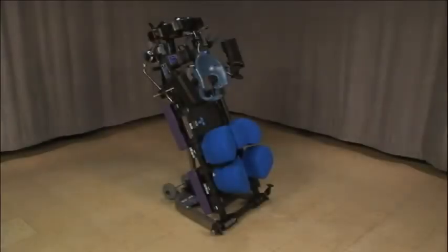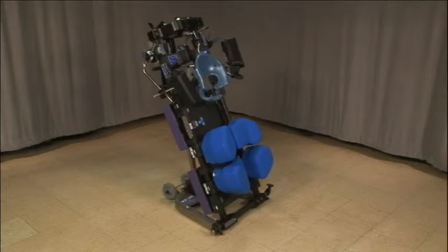The FlexFrame doubles as a storage cart. Most of the accessories can be stored right on the frame for easy access.